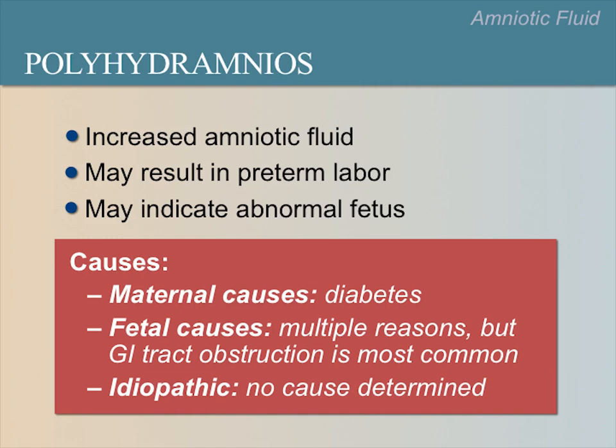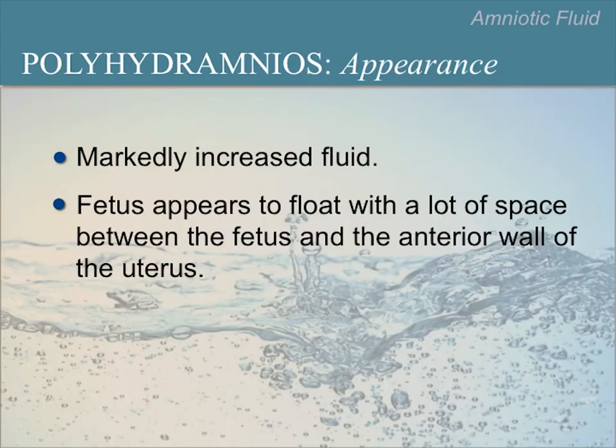With polyhydramnios, you will easily see the excess fluid on ultrasound. The fetus will appear to float with a lot of space between the fetus, uterine wall, or placenta. This is a sagittal view of a fetus with polyhydramnios. Notice the large amount of amniotic fluid between the fetus and the anterior wall of the uterus.